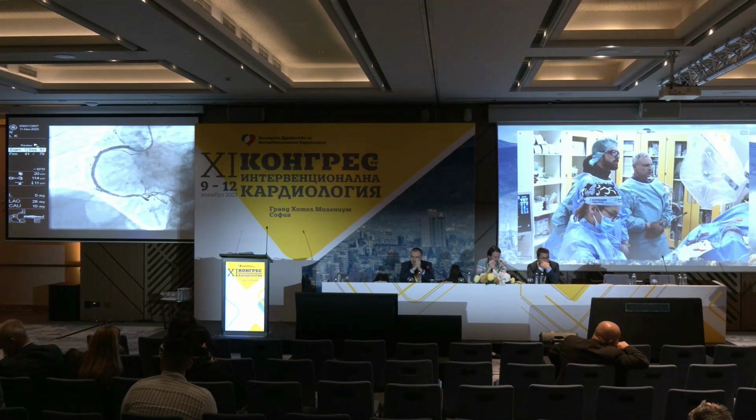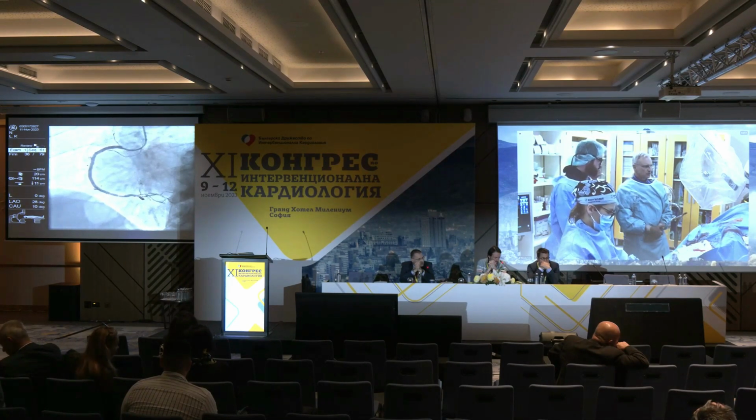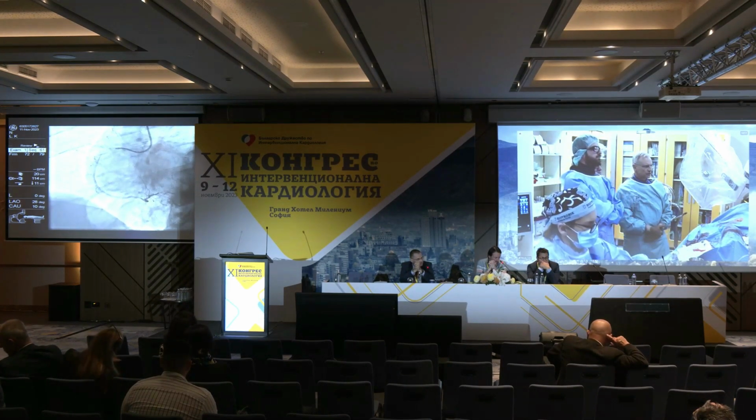Any comments from your side? We're happy with this. We agree, both me and Dr. Gelev, that we should do nothing. Congratulations. At this end, but watchful waiting.